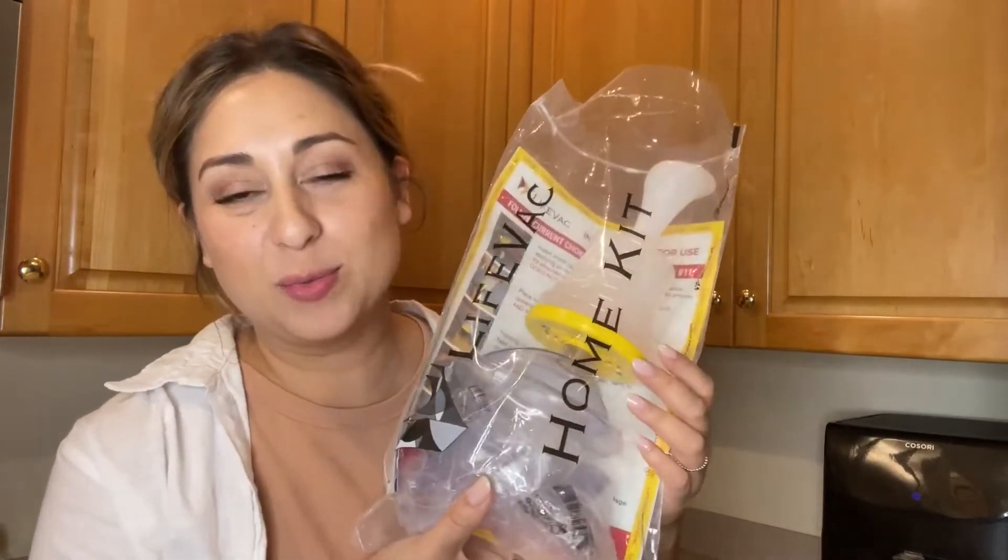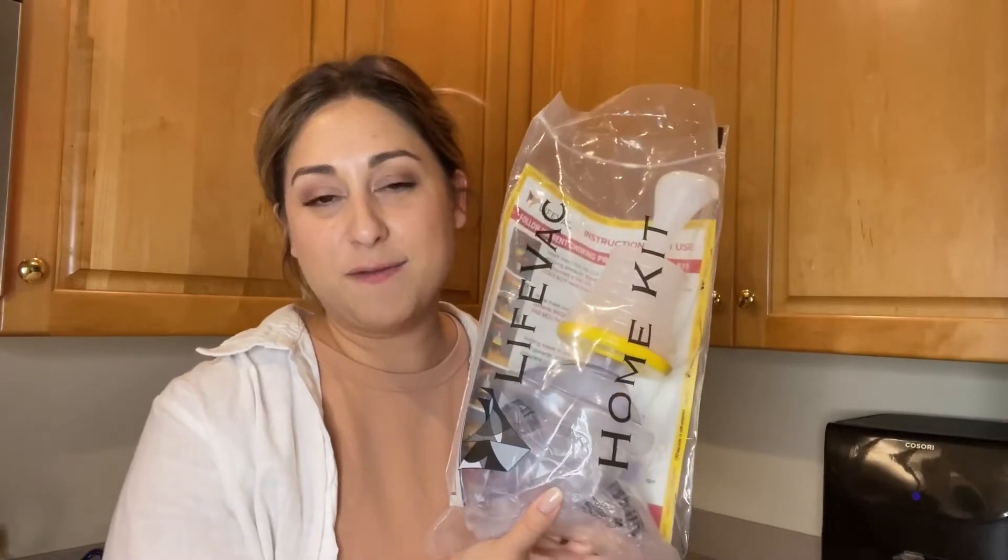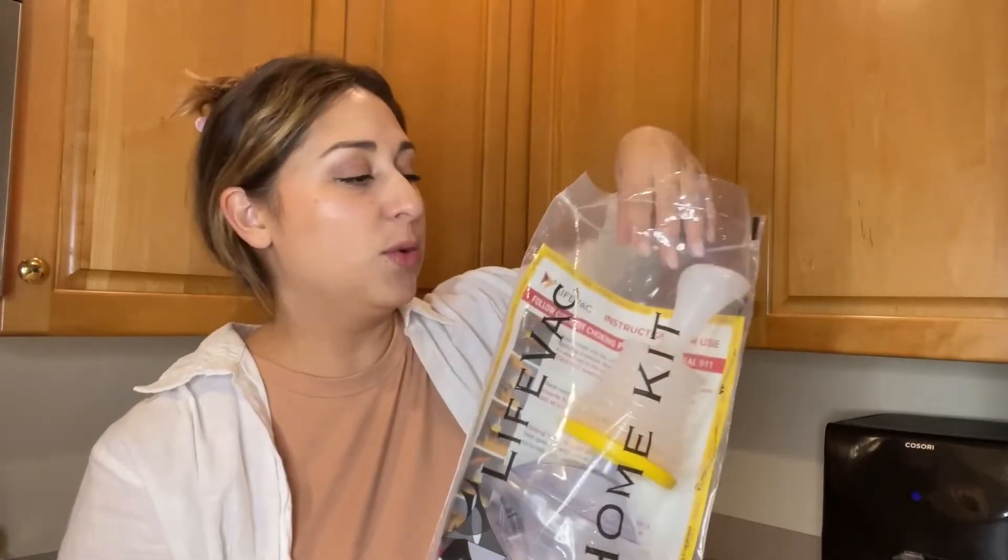Hey everyone, it's Paola from WTI. I want to talk to you about something really important that I like to keep in my medicine cabinet — it is this LifeVac home kit. You might have seen this on TV before.